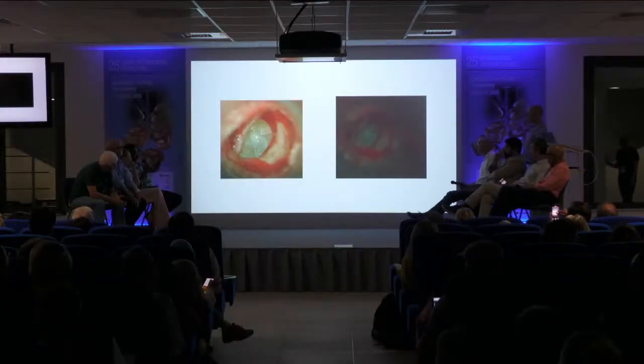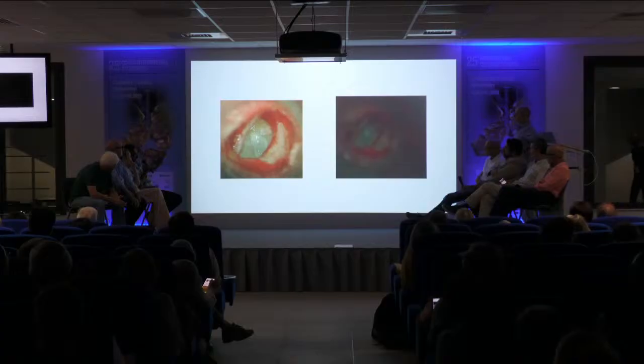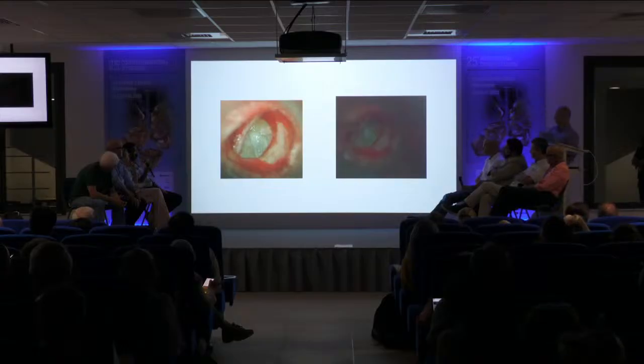So I'll just put a small piece of cartilage onto the foot plate, and it's within assembly. So you'll put the cartilage onto the foot plate and rest it underneath the incus. Yes. And it just sits. It's not cemented. It just sits there. No glue. Okay. Diane, what do you do for this one?